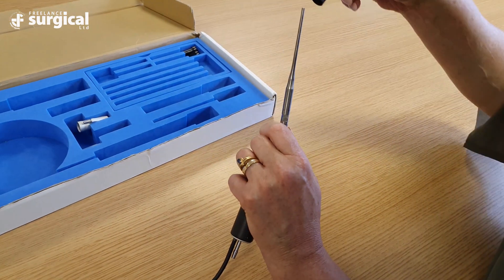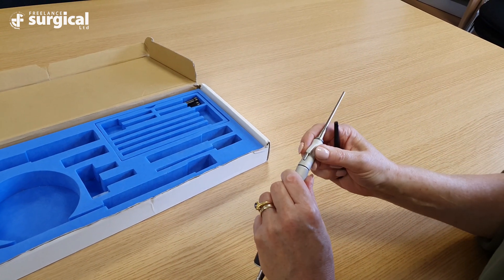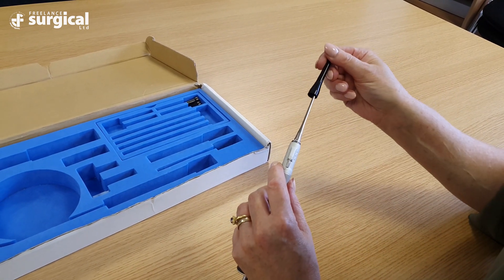Next, attach the smaller silver fluid guard with the connector facing upwards and finally attach the tip guard over the tip securely.